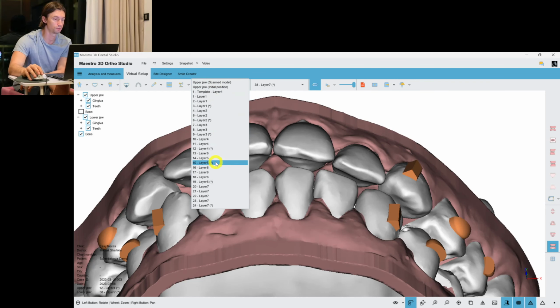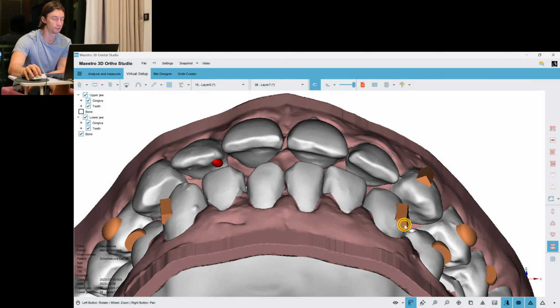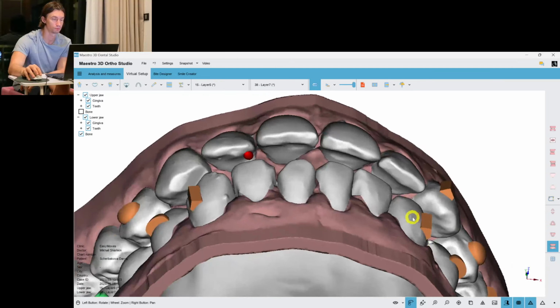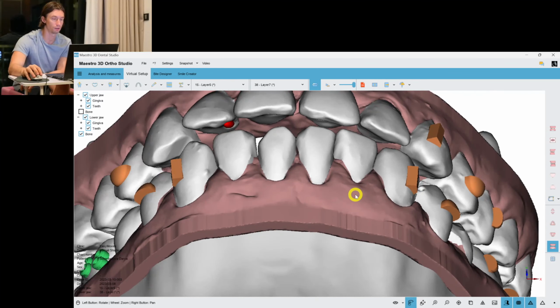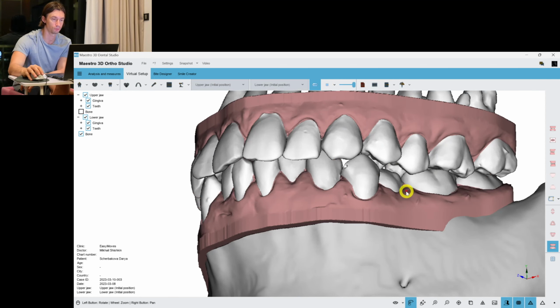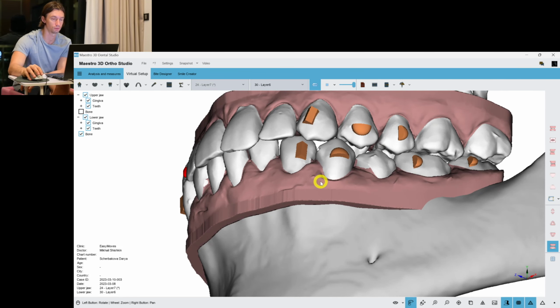But the upper jaw teeth expand only until aligner 15, so we'll need to keep some sagittal gap until the lower teeth are proclined, and we will need to make some custom schedule of the change of the aligners.